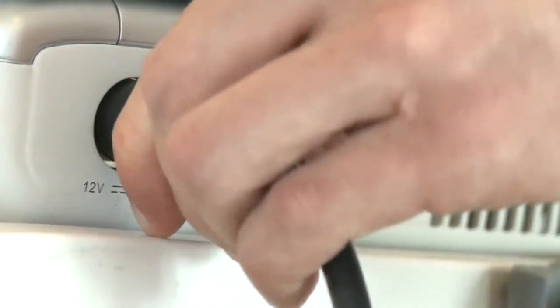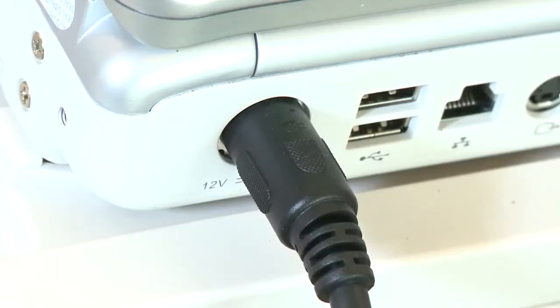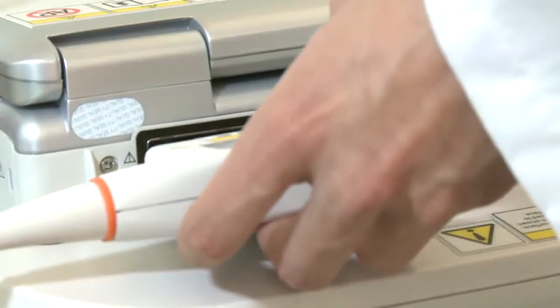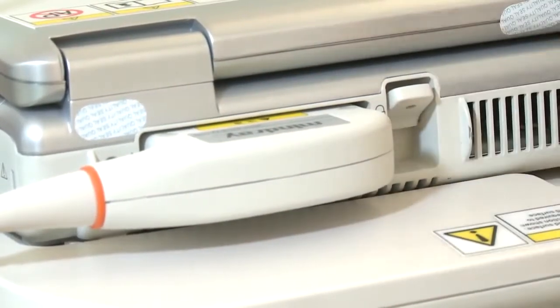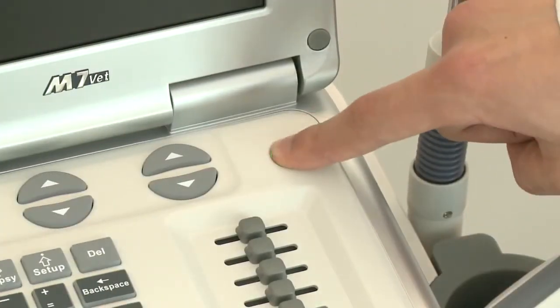Connect the power cable. Plug the probe into the connector and lock it. Then power on the system.